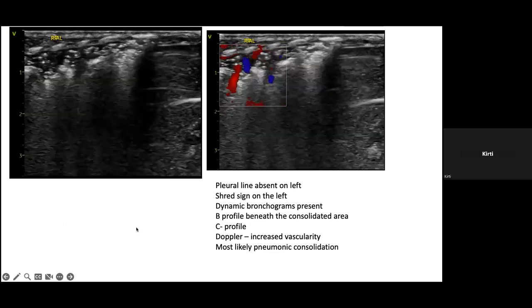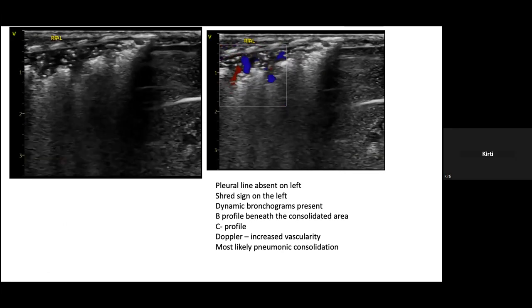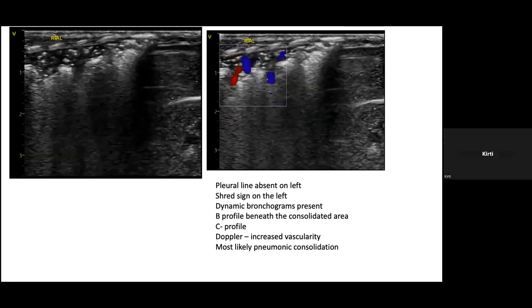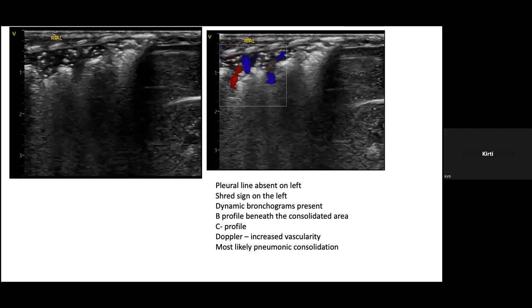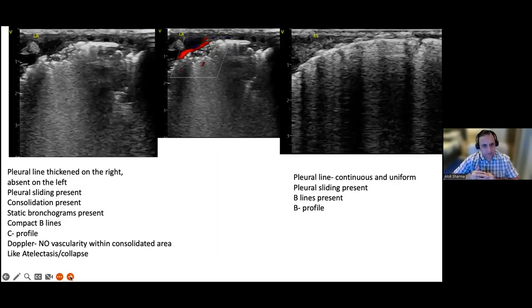Yeah, later on it came back as 25 and the total count was 28,000. And did you grow anything? So far, there's no growth. But there is some history of maternal infection. She had tachycardia, high CRP, fever. Maybe. Yeah. Lovely, beautiful images.